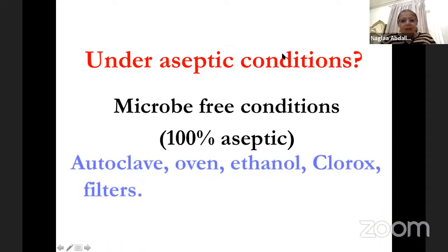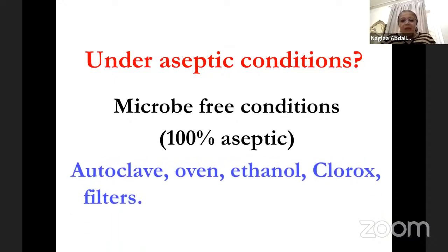It should be 100% microbe-free. It should be autoclaved, oven-sterilized, ethanol-treated, or Clorox-treated.